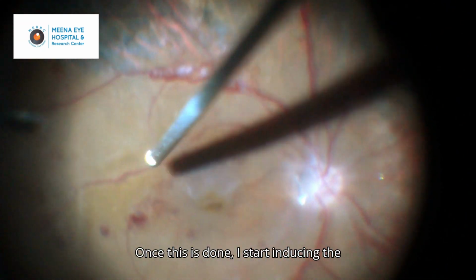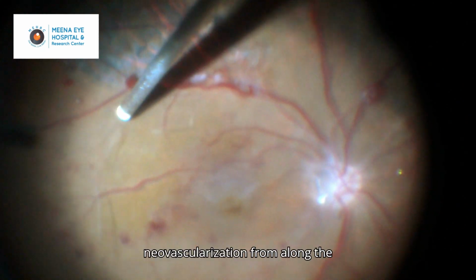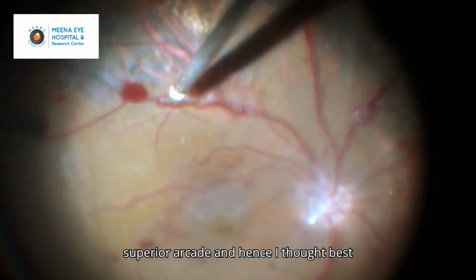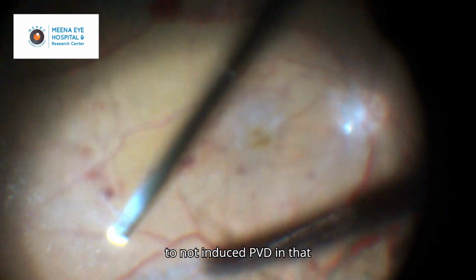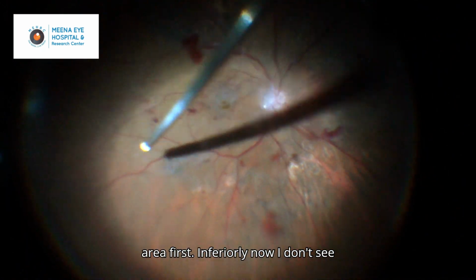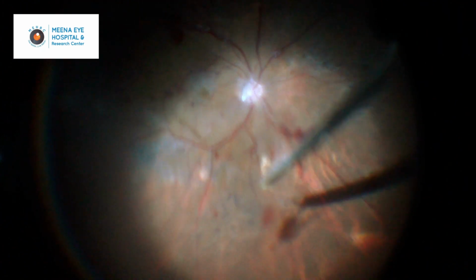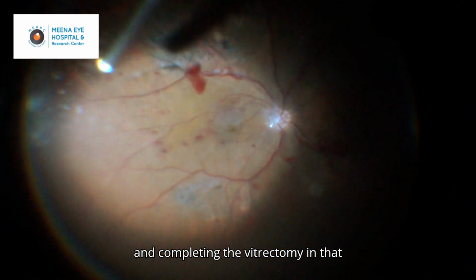Once this is done, I start inducing the PVD again, but here I notice the neovascularization front along the superior arcade, and hence I thought best to not induce PVD in that area first. So inferiorly, now I don't see much of NVs, and so I could induce PVD and complete the vitrectomy in that area.